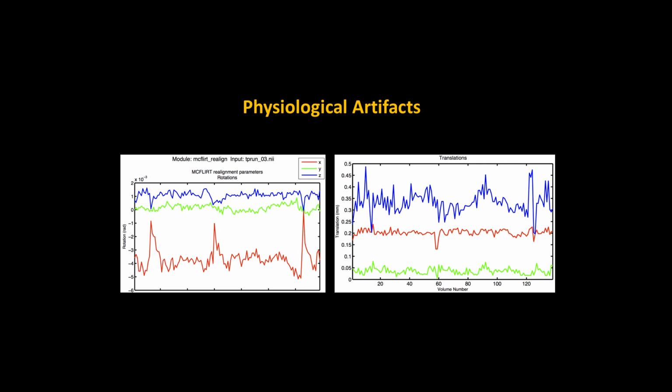Also, if you're working with populations such as children, God bless if you do, it's a very difficult population. I do not scan them. But if you do, usually, in my experience, the people who do scan them have a little bit more lenient motion thresholds. I'm seeing some nods. I'm seeing some very traumatized researchers, battle scarred, seeing all kinds of motion. Oh yeah. So in that case, it really depends on what kind of protocol your lab has written up for what you're willing to deal with.